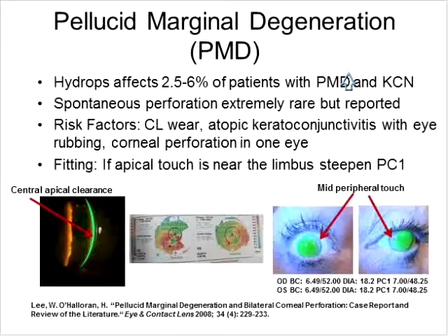So Melissa, do you know another manufacturer other than Visionary that can make a front toric? I do not. Dr. Johns? I believe Trueform can do front surface torics. I think you may be right.